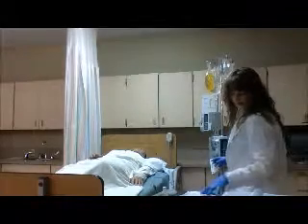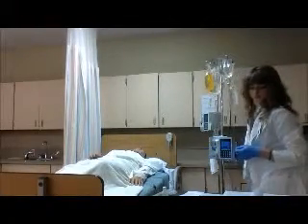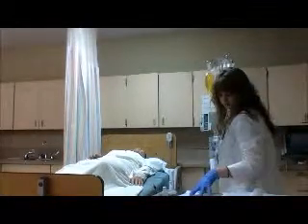So I already have my D5W running at 25 milliliters per hour, so now I'm going to set line B. Okay, so line B will be running at 20 milliliters per hour.